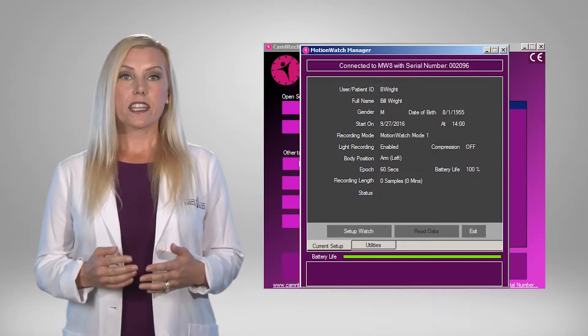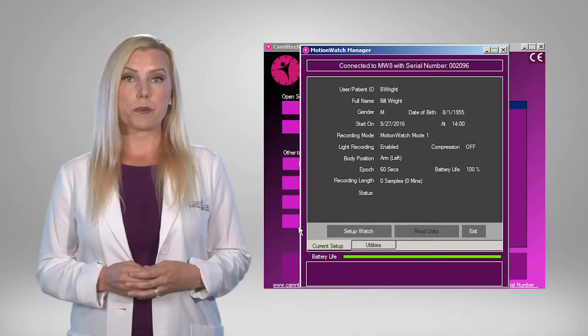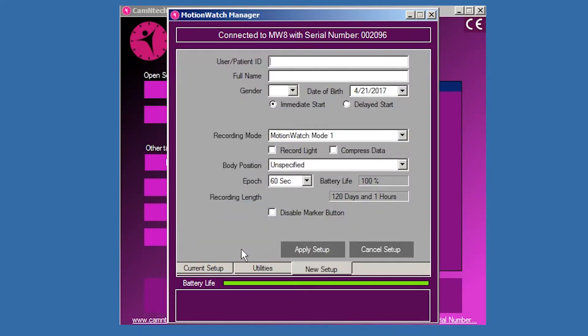Click the Setup watch button. The new Setup tab is activated and the settings may now be edited. The start date and time used for the Motionwatch 8 data collection is taken from the PC clock. Ensure that the correct date and time are displayed on your PC. Be aware that daylight savings time changes can offset data by an hour if the computer automatically changes time.